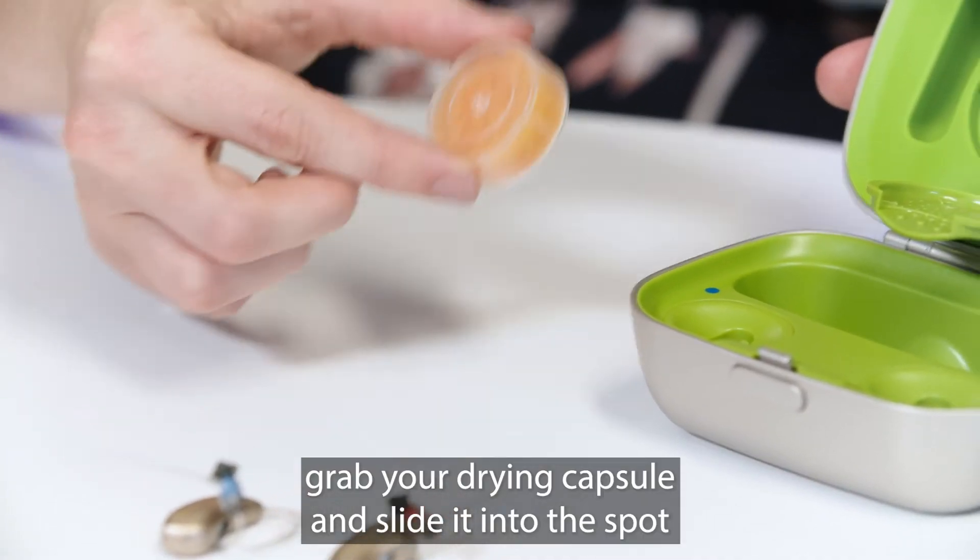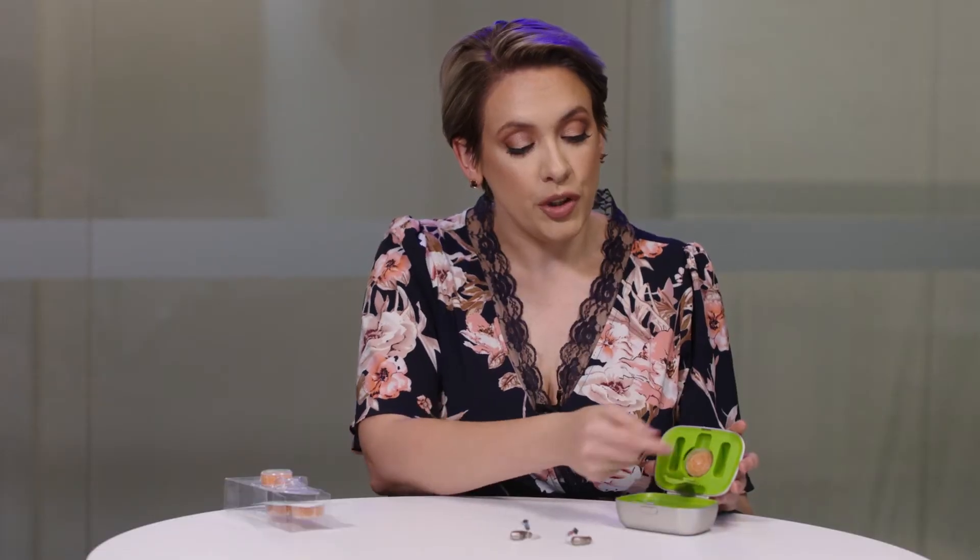Grab your drying capsule and slot it into the spot. You can now close this.